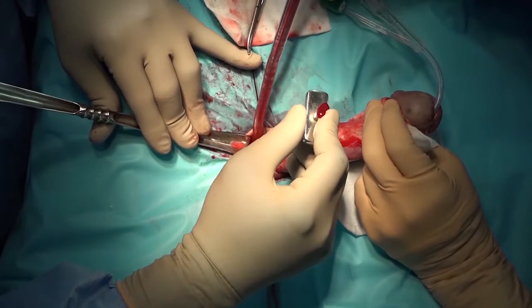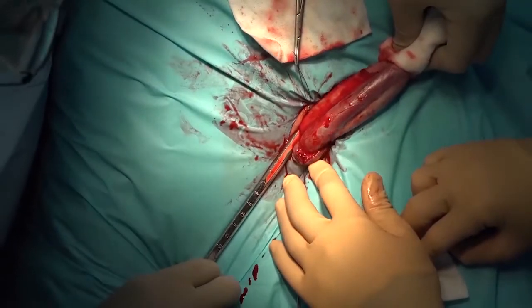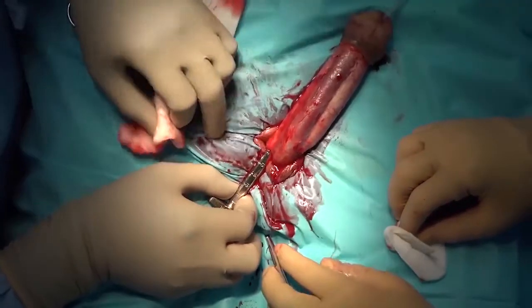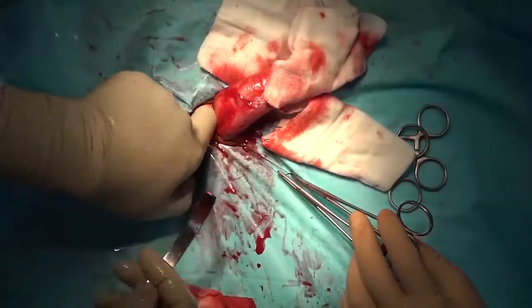Measurement and dilation was done with the Furlow insertor. The reservoir was placed in the space of Retzius.